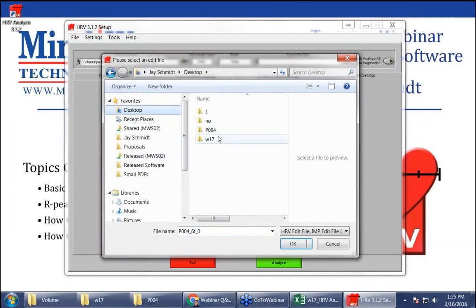I think I had it in here. So this right here is what the EDH is, basically only the edits that you've had for that one. So those are the difference between the two. If you were to try to load the EDH in the beginning, it wouldn't work. So you still need to load your MWI, and then you load the EDH later, which is your edited data. And then the snap to peak and midbeat peak functions.